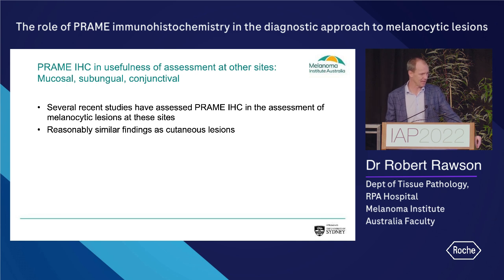Just briefly coming to the end of different uses, people have looked at it beyond cutaneous melanoma in mucosal, subungual and conjunctival sites and have found similar findings in unambiguous lesions. It hasn't really been looked at in ambiguous lesions in these sites yet.